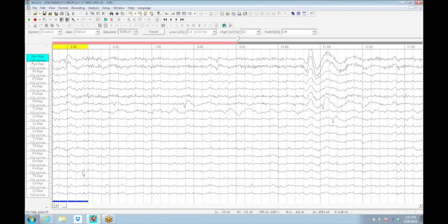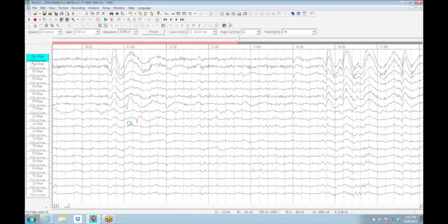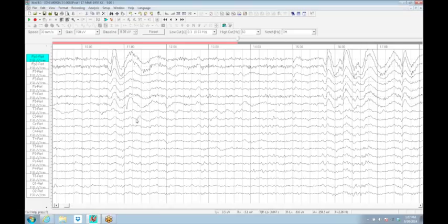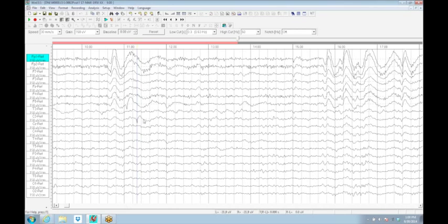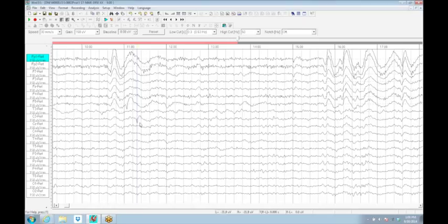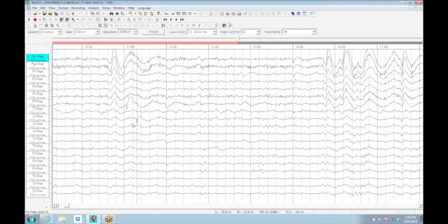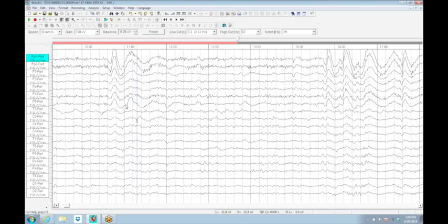That C3 electrode is a small electrode issue. You can tell it's a single electrode because at that point in time, there's no field. There's no similar waveform or content in any other location. That cannot happen from inside an intact skull. If you have a generation of voltage like this, it'll be seen at adjacent electrodes with a phase relationship. This at F8 and C3 are individual isolated electrode pops.